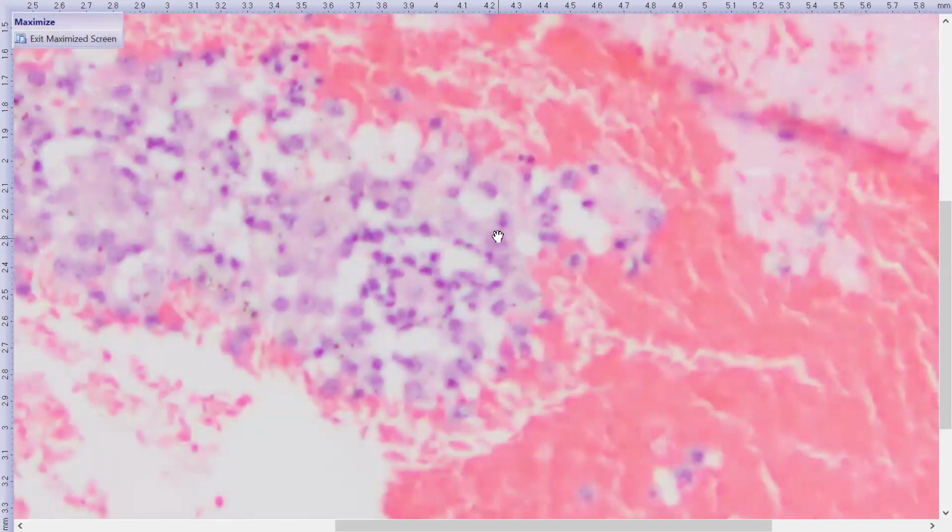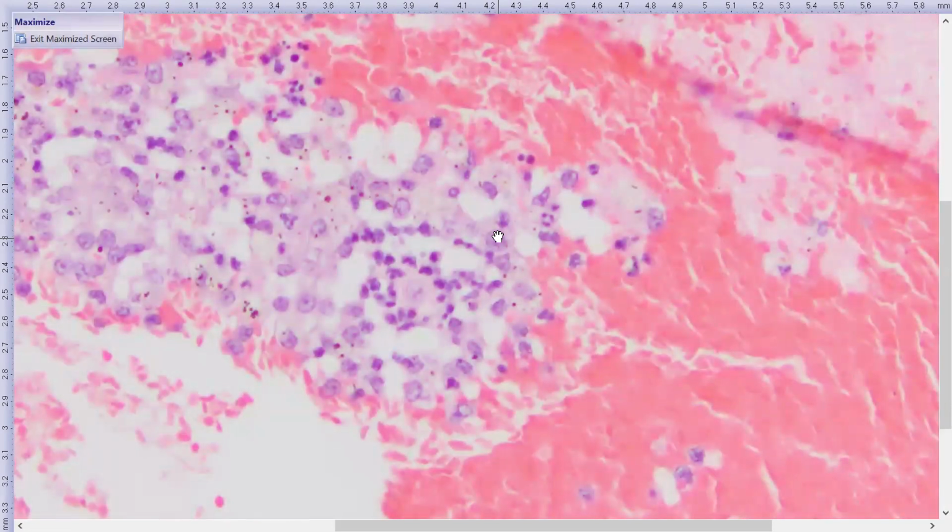So this is probably the more likely differential for that gross presentation, a fungal endophthalmitis. This is a yeast organism, and there's a couple of dimorphic fungi that can infect the eyes of dogs. Probably the most likely for a case like this is going to be Blastomyces dermatitidis. So we did that as a differential, although I did not see any budding pairs, and there were actually very few organisms overall in this eye.